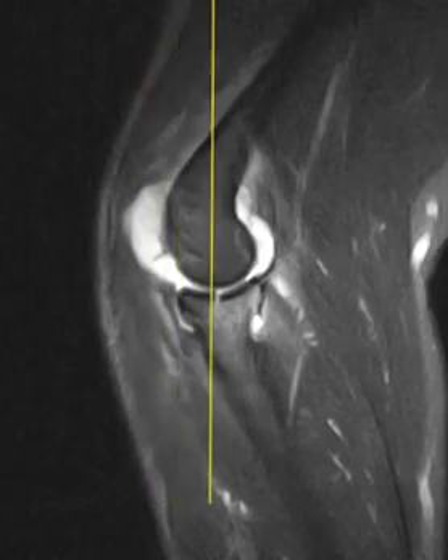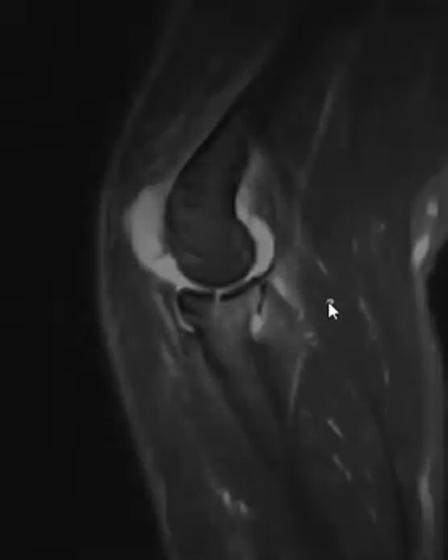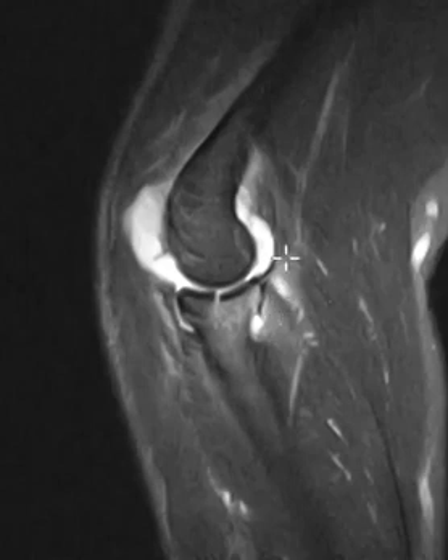Here we were slicing through and came to the edge — it looked good — and we went to the next slice, it looked good, so we didn't go right through the middle of it. But on this view, which is 90 degrees to the last, we can see the fracture line clearly going right through the middle of the articular surface. And on x-rays, this is not very displaced, so very difficult to see unless you just happen to catch it at the right angle.